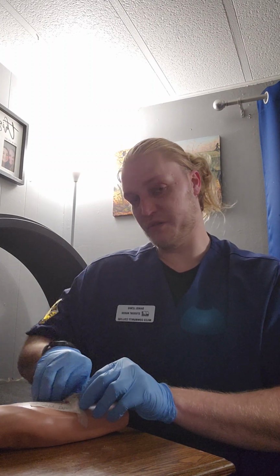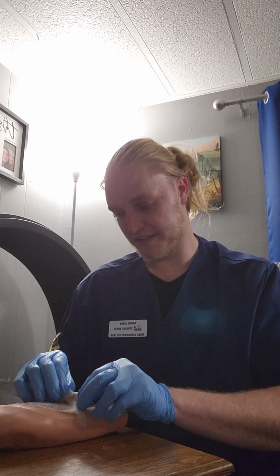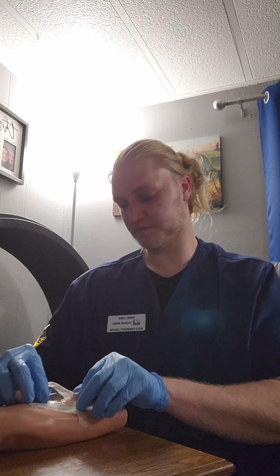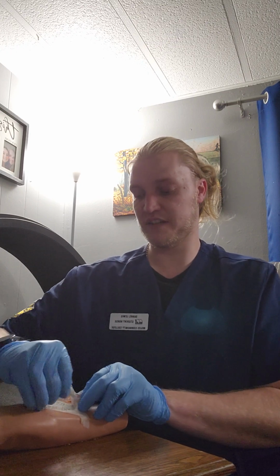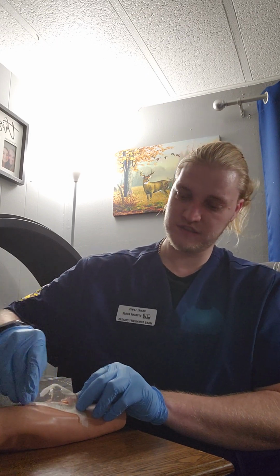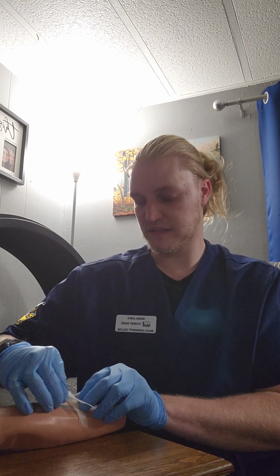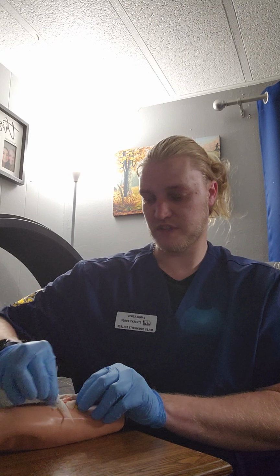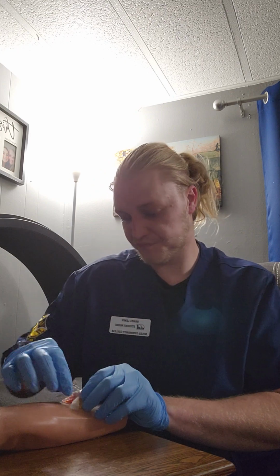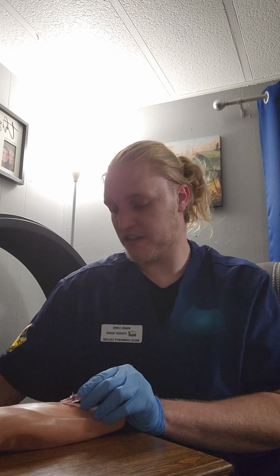And now that I've done that, I'm going to secure this and start to loosen the tape that is actually holding the IV catheter in place. And I'm going to secure it while I do that so it's not pulling on it. I can't get this tape. There we go. Sticky. Alright, so I'm going to get that off my gloves. And I'm going to peel the tape and everything off.